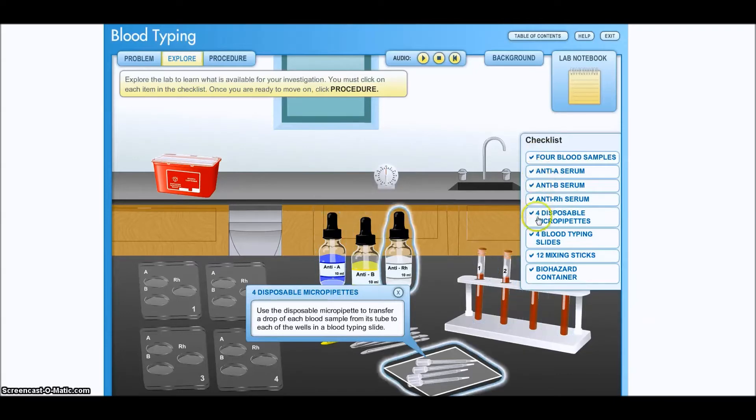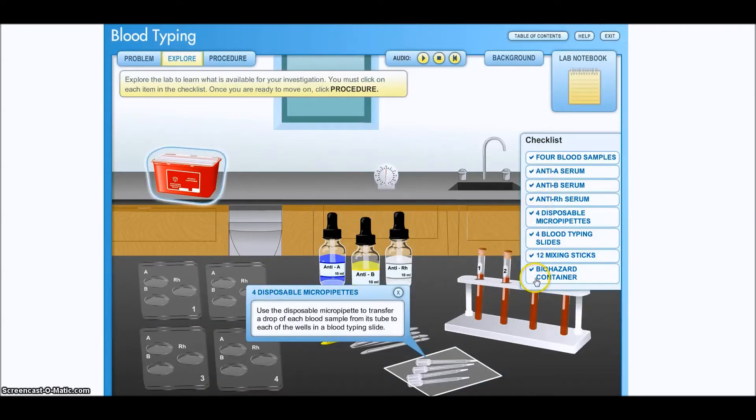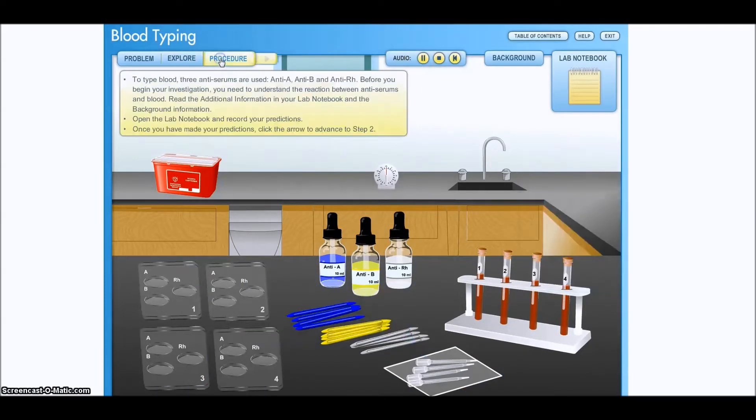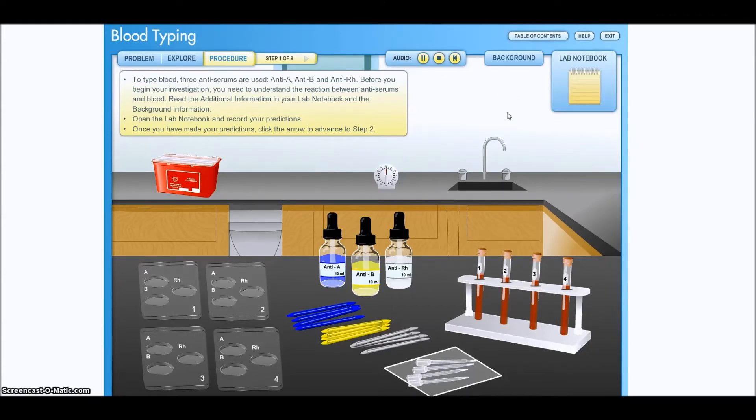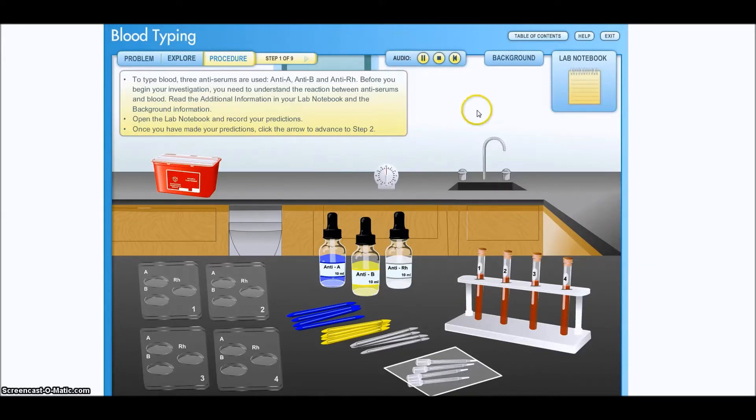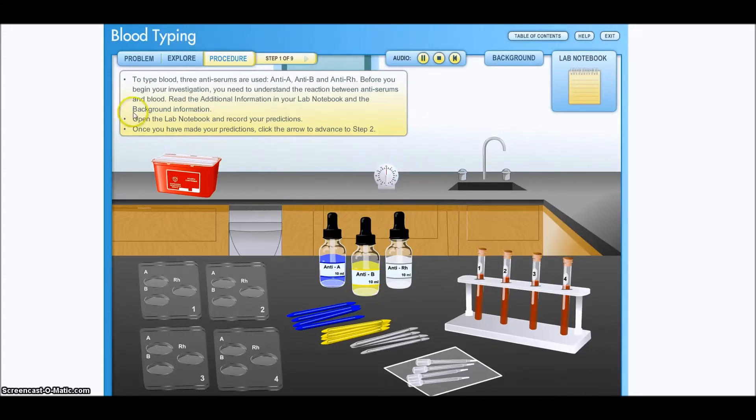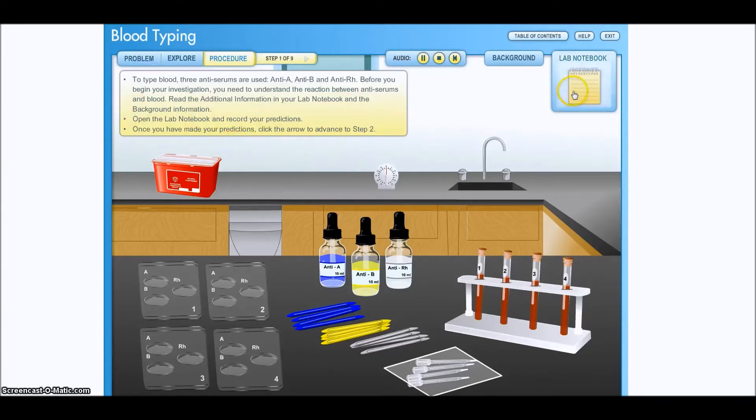You notice that all of these check marks come up on this checklist, so we're ready to go. To type blood, three anti-serums are used: anti-A, anti-B, and anti-RH. Before you begin your investigation, you need to understand the reaction between anti-serums and blood. Read the additional information in your lab notebook and the background information. Open the lab notebook and record your predictions. Once you've made your predictions, click the arrow to advance to step two.